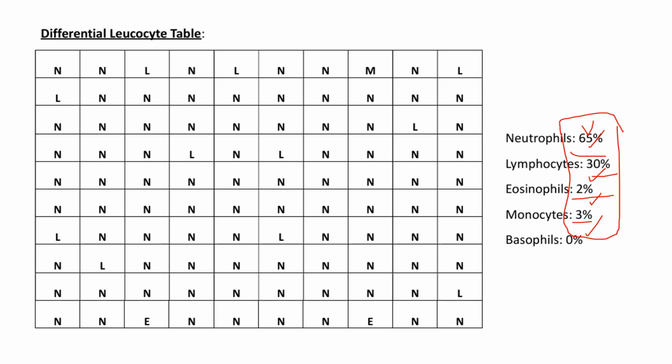So I know a lot of people will just try to write whatever they want in that box, and the blunder they make is that when they eventually add up, you'll get 104, 105, or some people get 95, 96. So it clearly tells the examiner that you have just written whatever you want.